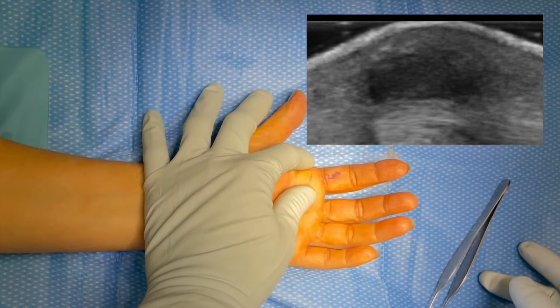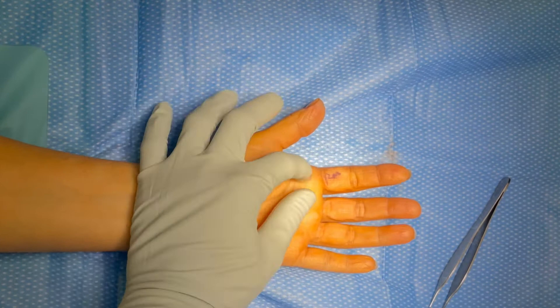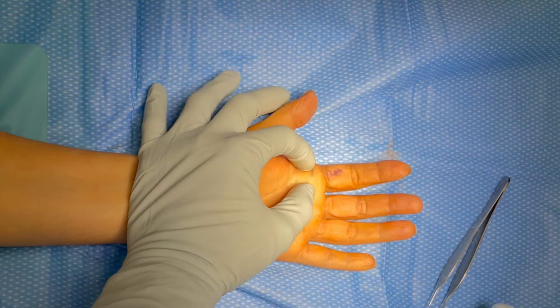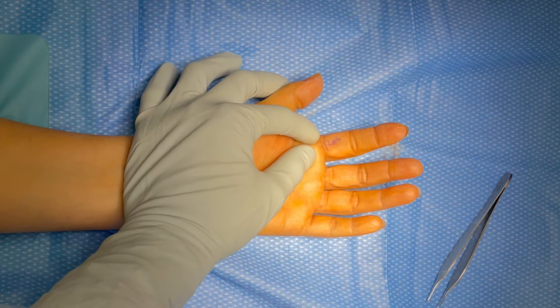You will see when we make the incision that the mass is sitting almost directly below the skin, very consistent with what we see on this ultrasound. We're testing that the patient is fully numb and palpating where the tumor is to decide where to make our incision. These tumors are usually painless — in this case the patient had no pain and she just noticed this lump which started spontaneously.